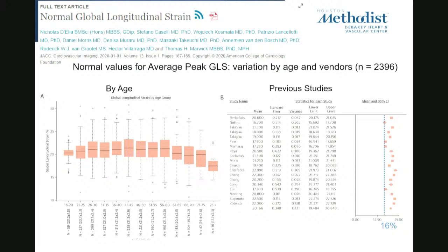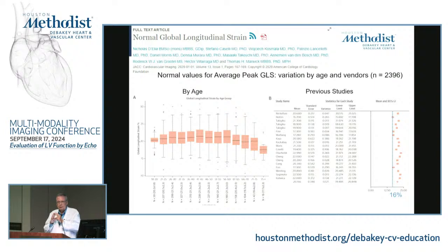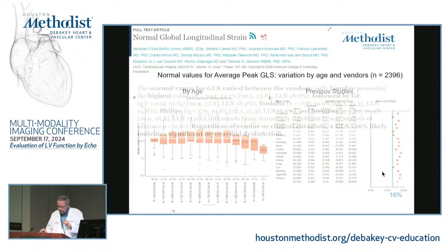I will show you that in a minute, okay? If you do the same patient with 2 machines, GE versus Toshiba and whatnot, there will be variability. That's the second important point. But regardless of age and regardless of variability, no one that is normal goes under 16. Everybody is at 16 or higher. Okay, that's a very important point.